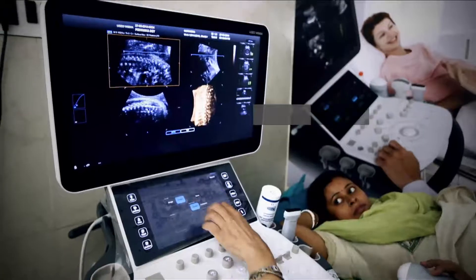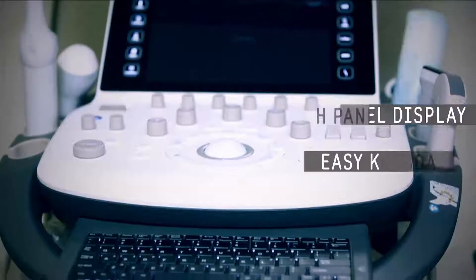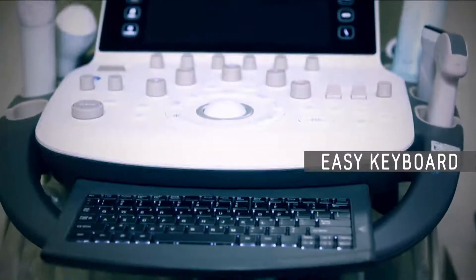User friendly — you don't have to type much. It's all a touch panel display; the keyboard is very easy. The color Doppler pickup is very good.